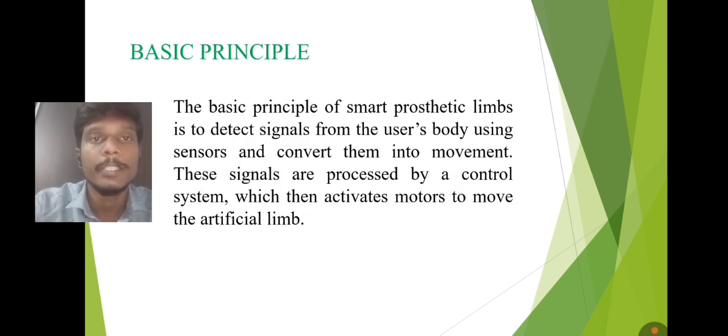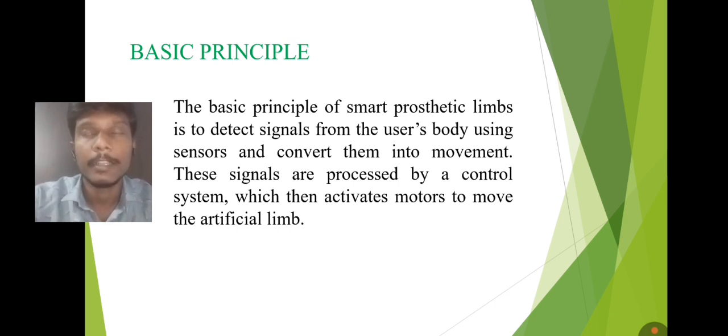Next, basic principles. It is to detect signals from the user's body using sensors and convert them into movement. It helps to sense and detect the signals and convert them into movement.